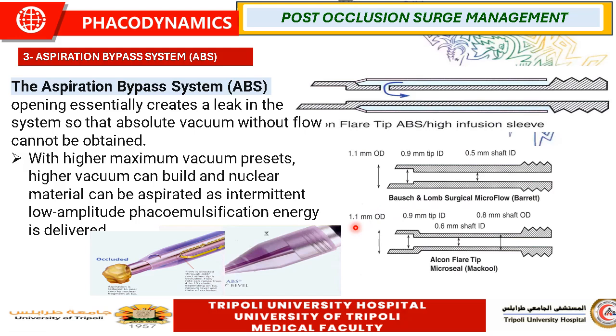So this is among the measures that utilize the Phaco needles to counteract or manage the post-occlusion surge: the presence of the ABS needles and also the micro tip technology.